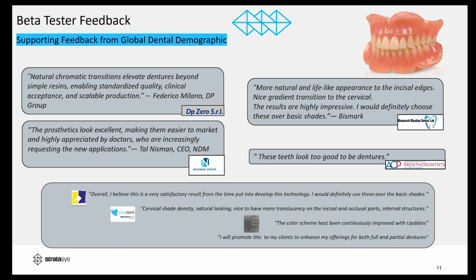Thank you for your feedback, Ken. I appreciate you sharing that. We do have some questions, Lior. Does the Voxel option have any impact on the resin consumption or print time? I just replied to it.